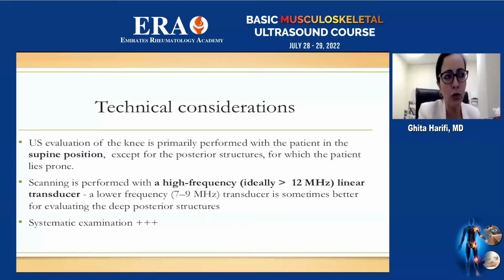A linear transducer, obviously, although a lower frequency transducer is sometimes better, or at least an adjustment of the frequency in the settings is sometimes important for evaluating the deep posterior structures.